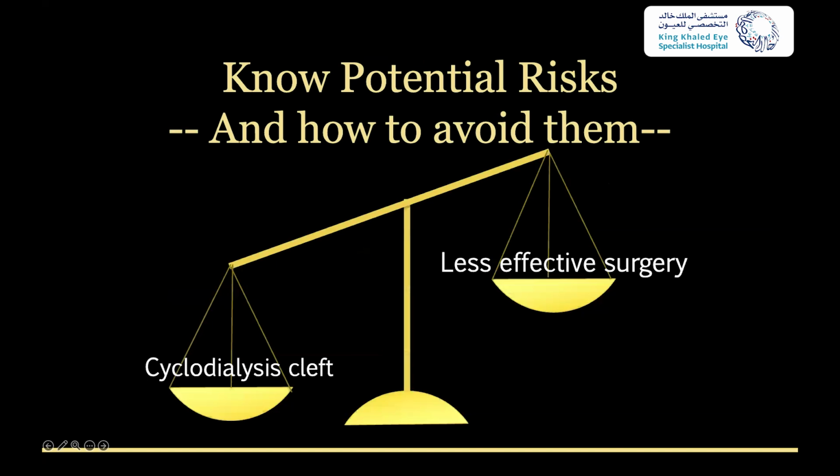And so if I'm not sure if I have a good enough visualization, or I don't have a comfortable enough position and feel like I could potentially end up causing a cyclodialysis cleft, I'm not going to continue where I'm at. Even if it means having a less effective surgery or a smaller goniotomy or stopping the GAT or canaloplasty early, I'll do that if I feel like that's going to be the safer move for the eye.